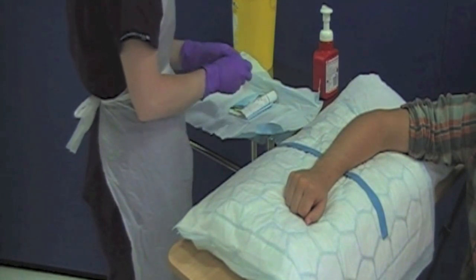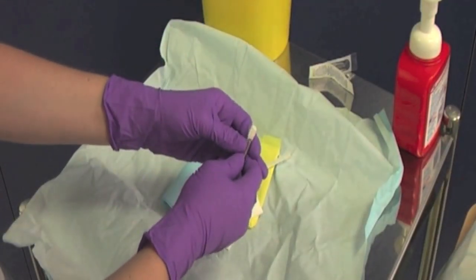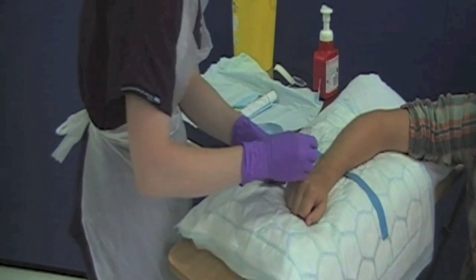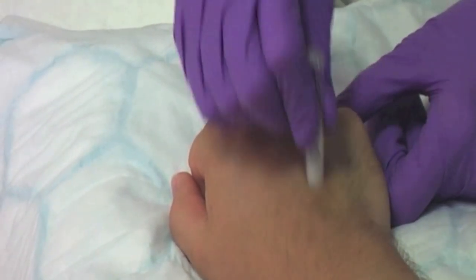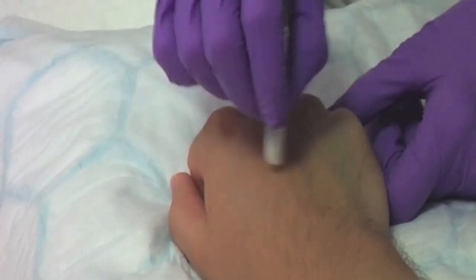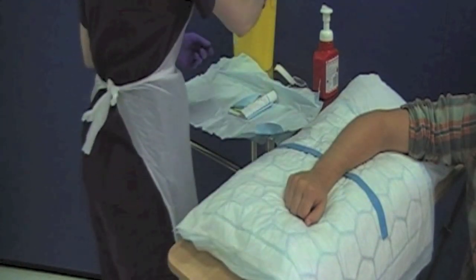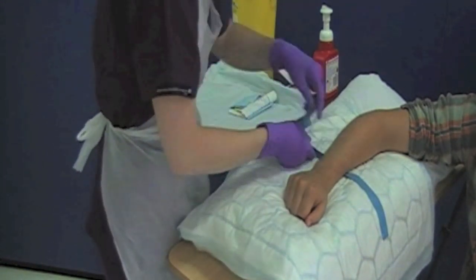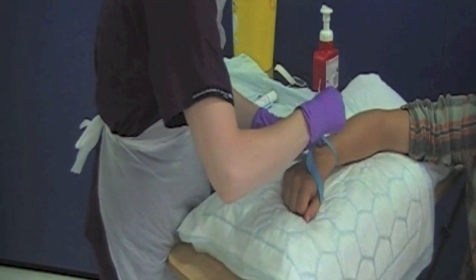Remove the ChloraPrep applicator from its packaging and squeeze until the inner tube breaks. This releases the ChloraPrep solution. Clean the proposed puncture site in a hash formation and allow to air dry for 30 seconds. Dispose of the ChloraPrep into your sharps bin. Reapply your tourniquet to help distend the vein. Do not repalpate the cleaned area of skin.